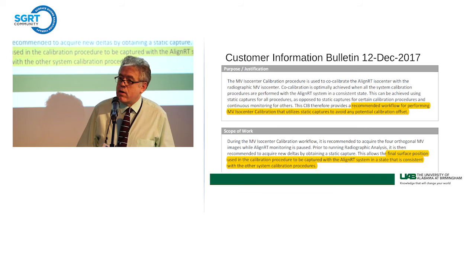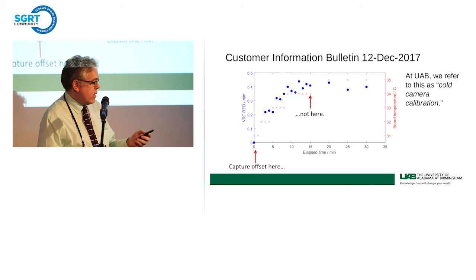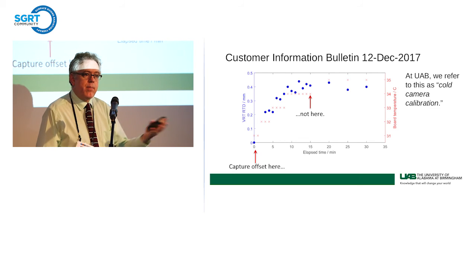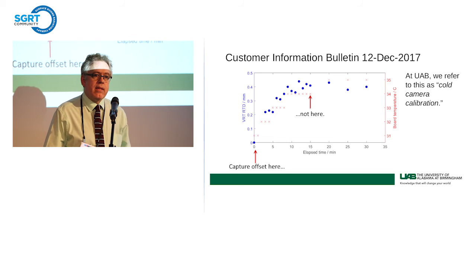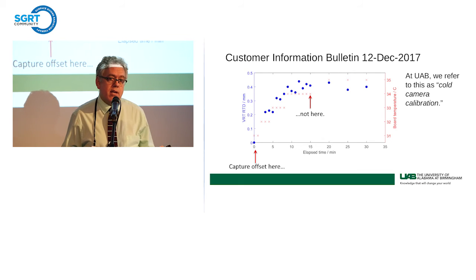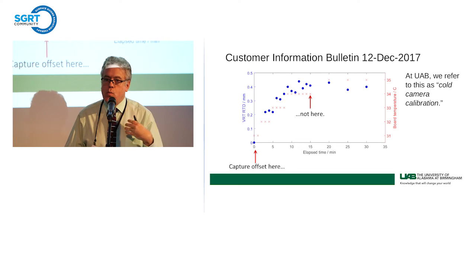Now, one thing we knew very early in our experience with the system was that it has a temperature drift. It has a warm-up time. And we measured it with a static phantom. I mean, this is nothing new. I think other users have seen this. If you put a static phantom on the table and you start monitoring, over approximately 10 to 15 minutes, you'll see a systematic drift in the reported position. And we correlated that with the board temperature reported by the cameras themselves, and sure enough, you see a correlation. And so our process for patient care is when we call the patient back into the room, the therapists start the monitoring process because that's where the warm-up is happening.